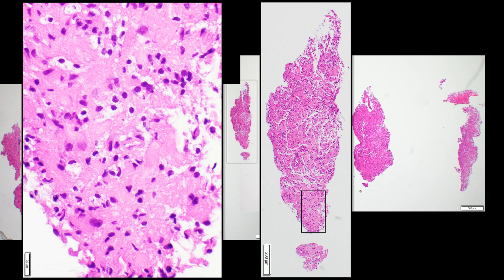The takeaway points — especially for general surgical pathologists who occasionally see brain specimens — is that if you see a macrophage-rich lesion, you need to back away from calling it tumor. There are a lot of things in the central nervous system that can have macrophages. Tumor is one of them — whenever you have necrosis you can have macrophages — but macrophages are also present in demyelinating lesions, infarction, and infection. Those are the major ones.